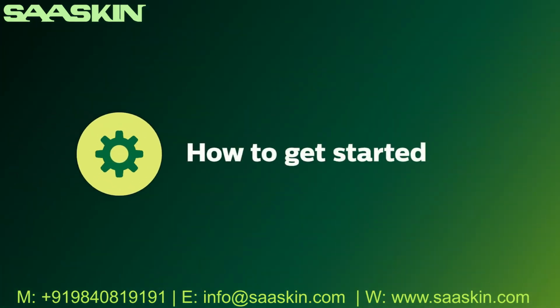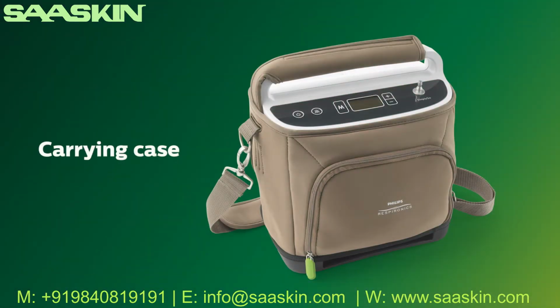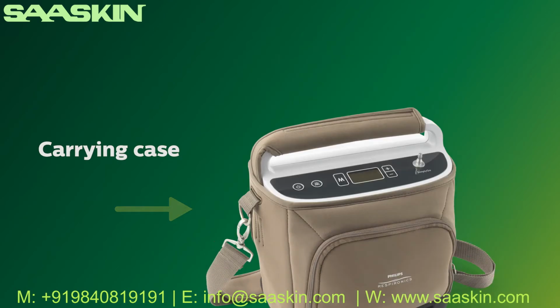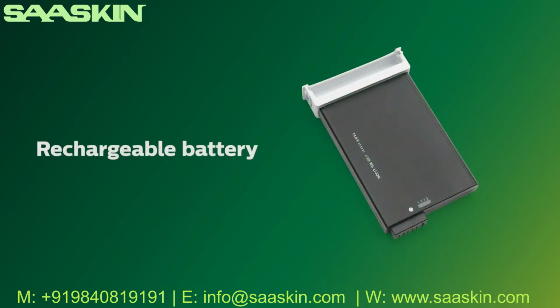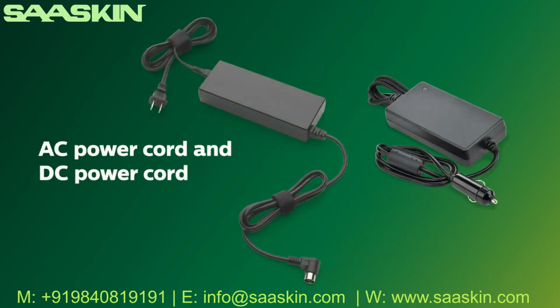First, let's take a quick look at what's included with your SimplyGo. SimplyGo comes with a convenient carrying case with shoulder strap to make it easy to carry. The rechargeable battery is designed to give you up to 3.5 hours of use while you're on the go. The battery was designed to fit easily. Do not force into place. You'll also have an AC power cord for use with standard outlets and the DC power cord for charging in places like your car.